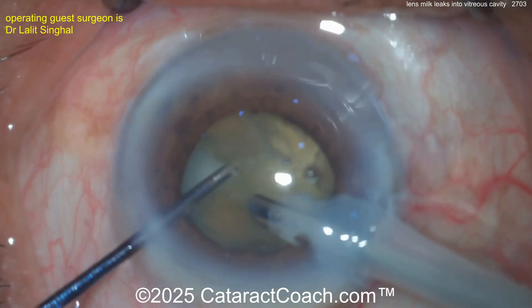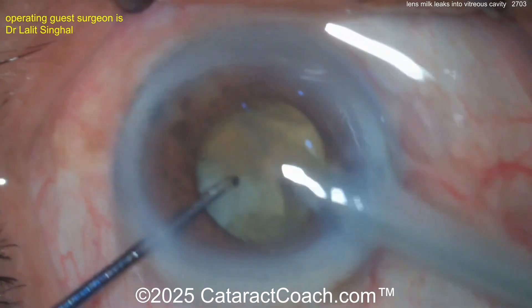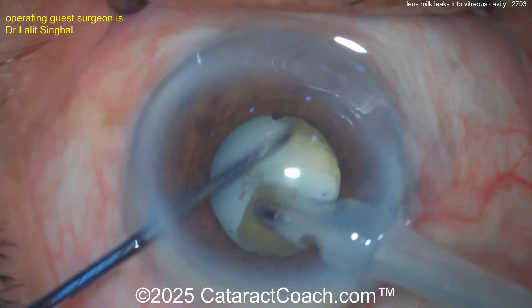The question is: what do you do about it? Do you stop and do a posterior rhexis now and try to wash it out? Do you do a pars plana incision and put a trocar in and try to do a little bit of an anterior vitrectomy? Or do you just wait it out? What do you do?